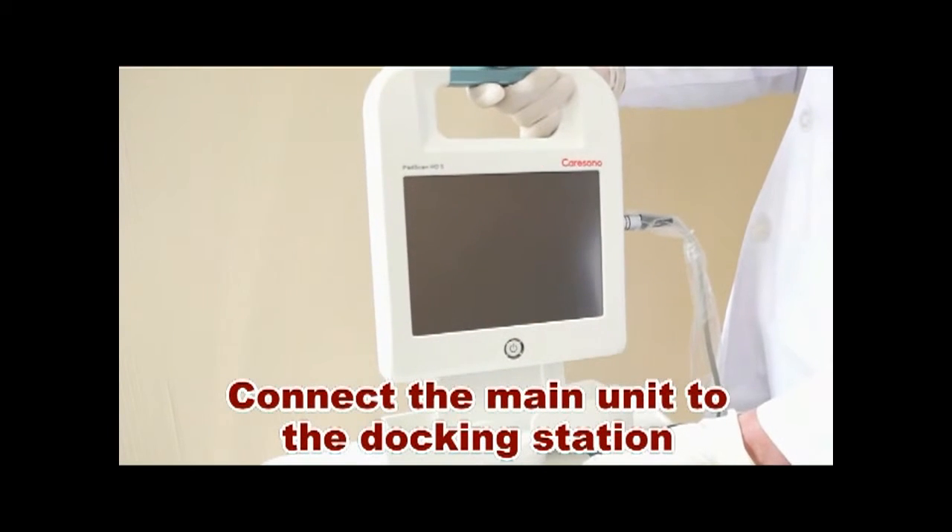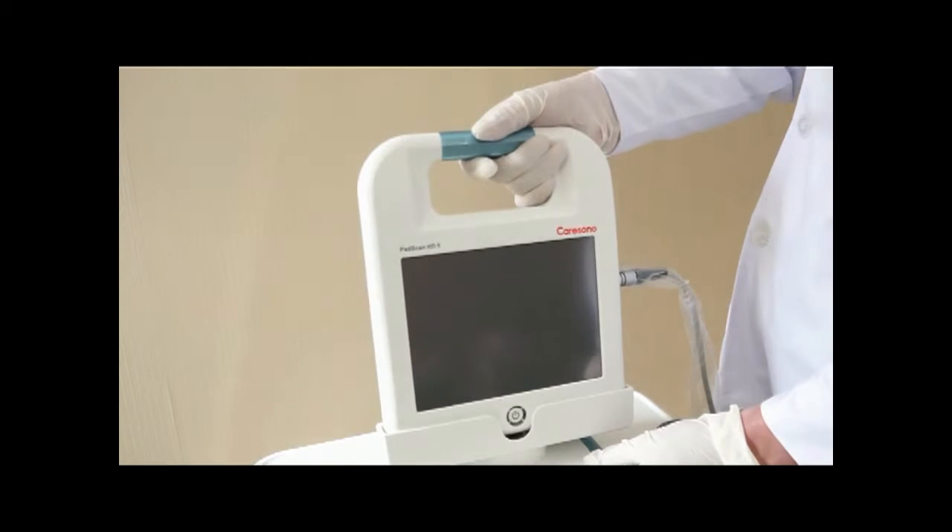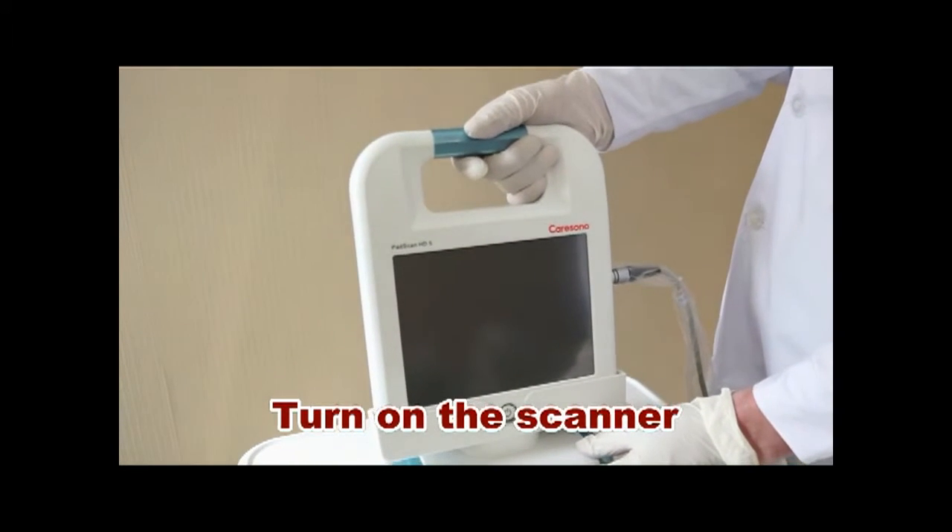Connect the main unit to the docking station. Turn on the scanner.